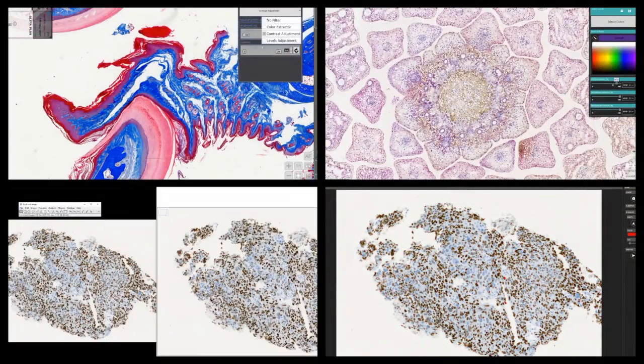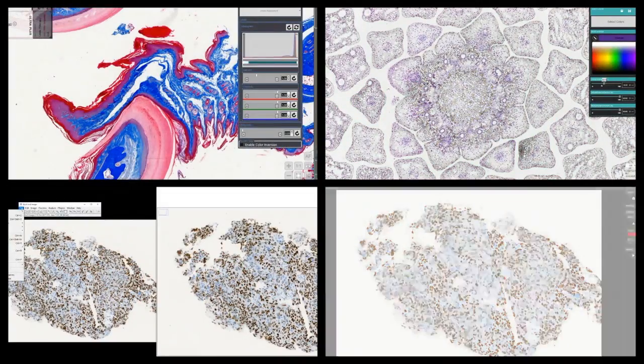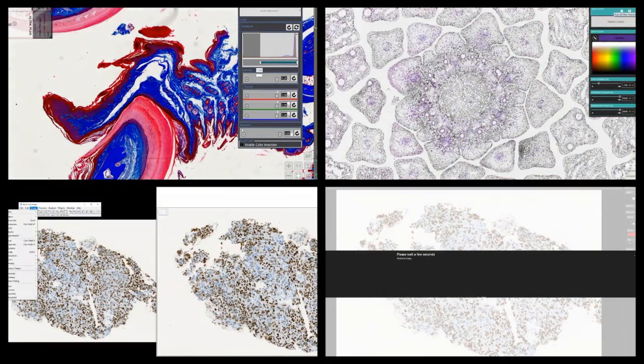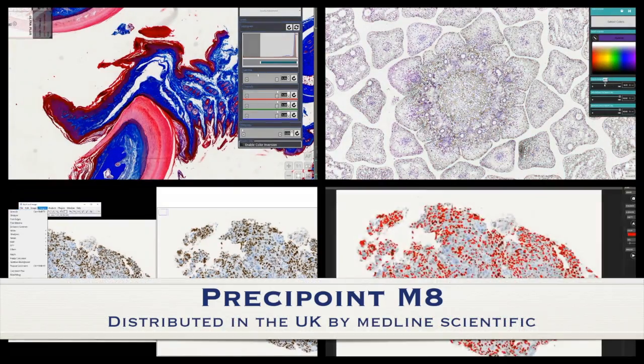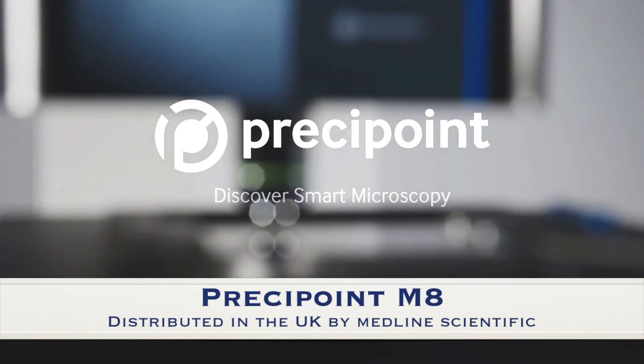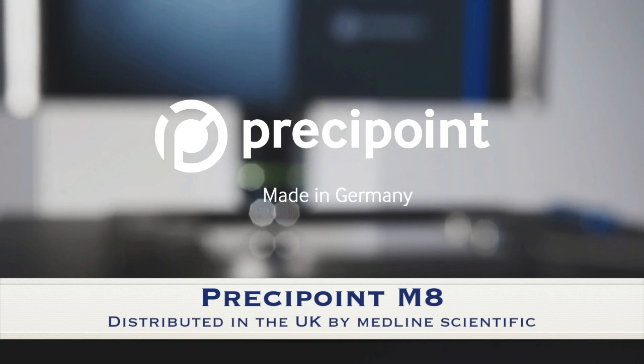This is the M8, a truly smart microscope. PreciPoint. Discover smart microscopy.